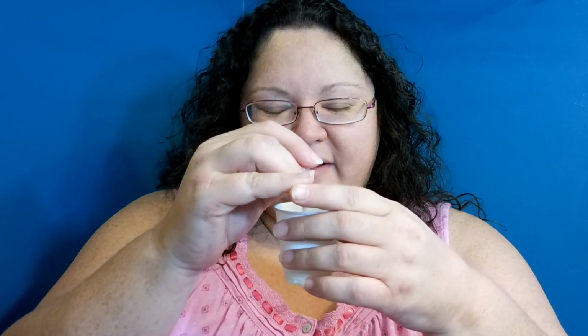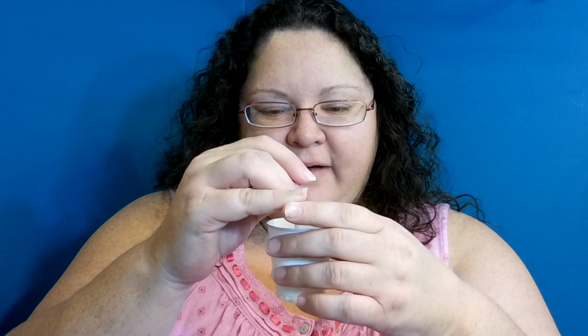And then I have a new brand that I'm going to be trying out for the first time today. I just want to get this one dipped. 1, 2, 3, 4, 5. Actually, I think that was supposed to be a 3. I may have just oversaturated. Okay, this is called Healthy Wiser.